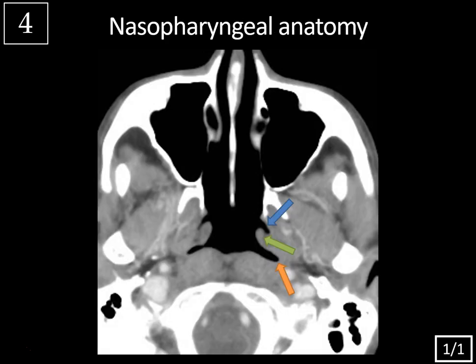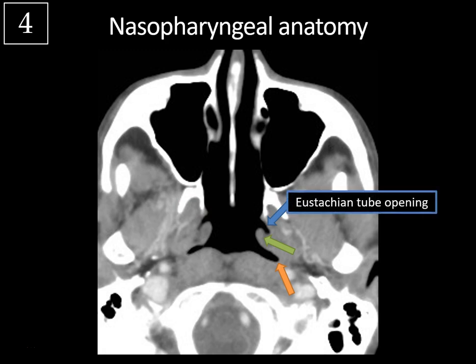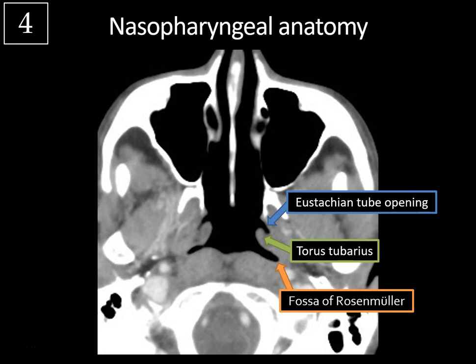All right, case four — name the nasopharyngeal anatomy here. We're looking at a cone-down image of the pharyngeal mucosal space at the level of the nasopharynx. You can tell we're at the nasopharynx because you have the osseous nasal septum at the midline, and you can see the pterygoid plates bilaterally. The anterior-most recess here is the eustachian tube opening. Just posterior to that is the torus tubarius — the cartilaginous portion of the eustachian tube. And then posterior to that, you have the fossa of Rosenmuller, also known as the posterolateral pharyngeal recess, which is the most common site for nasopharyngeal carcinoma. A nasopharyngeal carcinoma here can cause mass effect against the torus tubarius, obstructing the eustachian tube opening and giving unilateral mastoid effusion due to fluid backup. So whenever you have a unilateral mastoid effusion in an adult, look closely at the nasopharynx to make sure you're not missing a nasopharyngeal carcinoma.